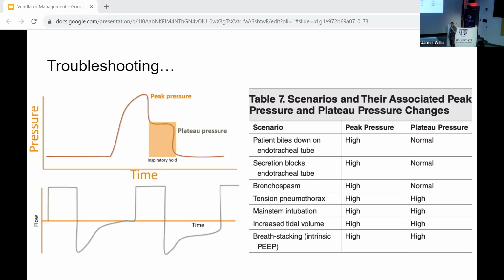Troubleshooting the ventilator. So what we've talked about so far is ventilator breaths, the modes. We've started ventilating a hypoxemic respiratory failure patient. We started ventilating a severe asthma obstructive airway patient and a severe acidotic patient. Those are 3 different physiological states that are unique ways to ventilate a patient. Troubleshooting.